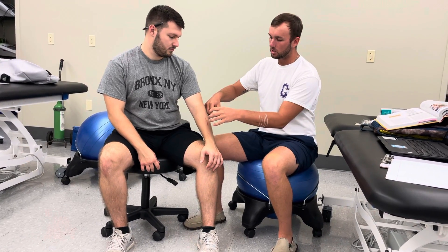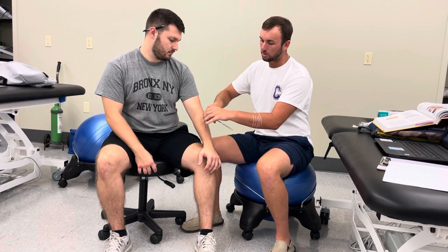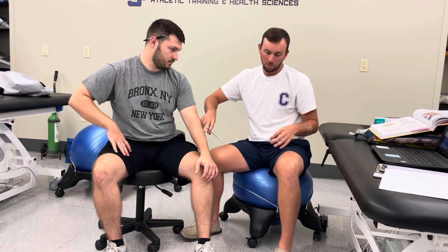When applying this, I'm going to put this side down further — down first — and then I'm going to pull it across, closing the wound right there.